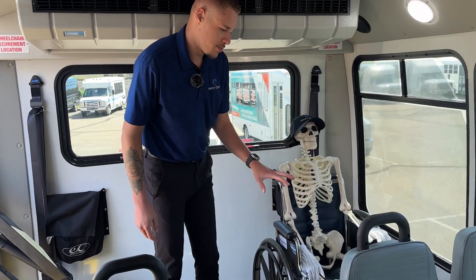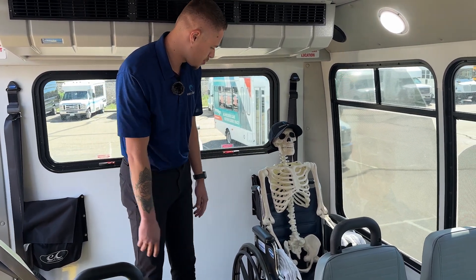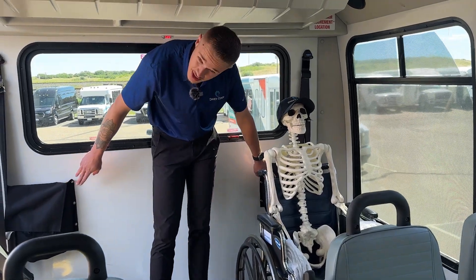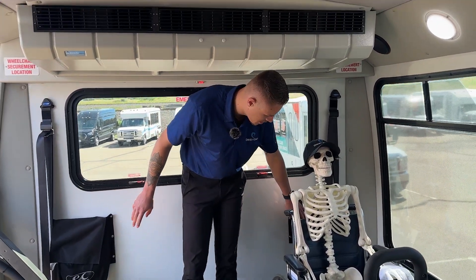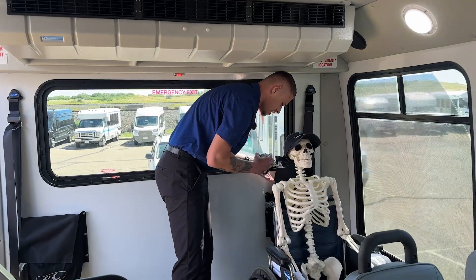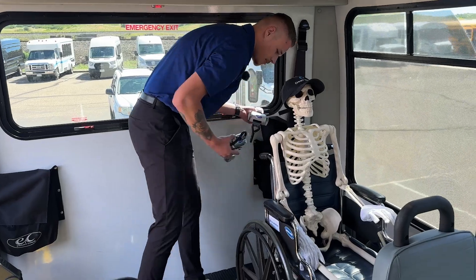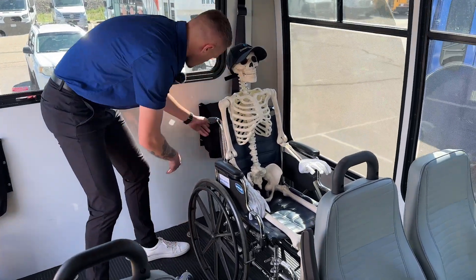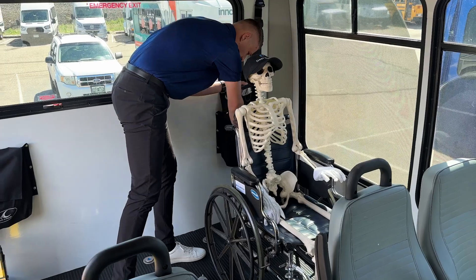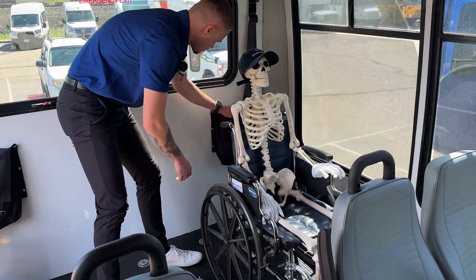Now that we're in the back of the bus, we're going ahead and securing Mr. Bones to his wheelchair spot on the floor. In either one of these bags you'll have a set of wheelchair securement pucks. We'll pull the one out for his position. Inside you'll find your Q'STRAINT QRT Max securements. We'll pull all of them out for the four points of the wheelchair.